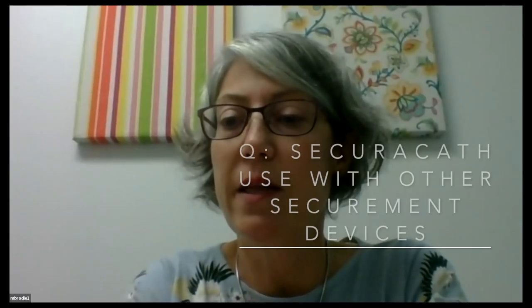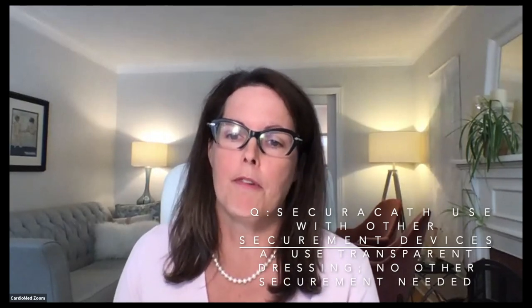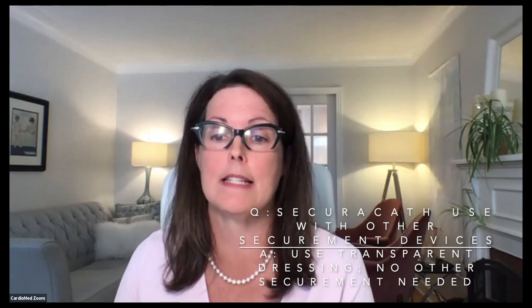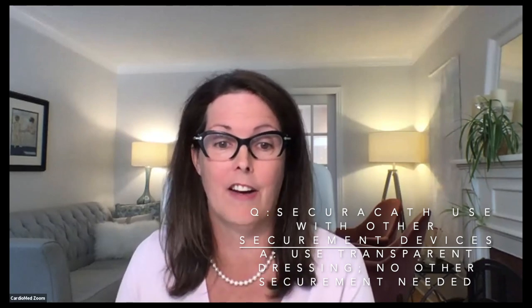There's another question here. How would we use the SecurAcath with 3M PICC CDC securement dressings used by both CELHIN and CLHIN? Those are two community regions in Ontario. So the 3M PICC CDC securement dressing is a securement device. It's an adhesive-based securement dressing. So it really would be overkill using both the 3M PICC CDC securement dressing as well as the SecurAcath, and very costly to the healthcare system.